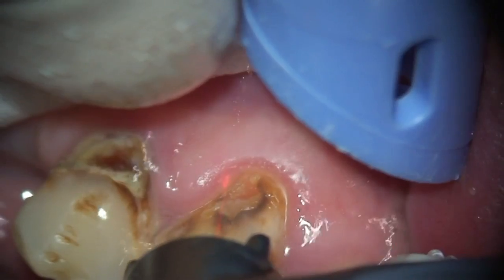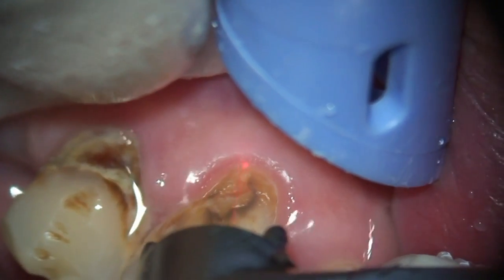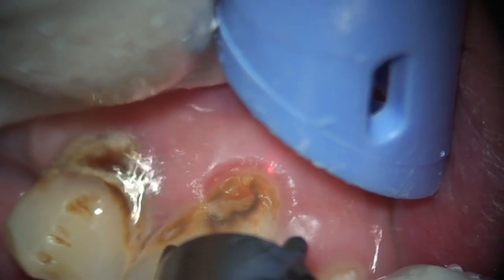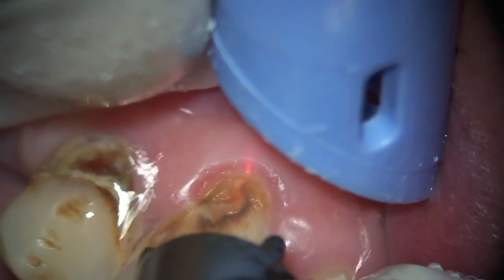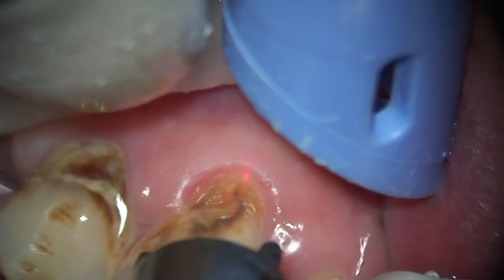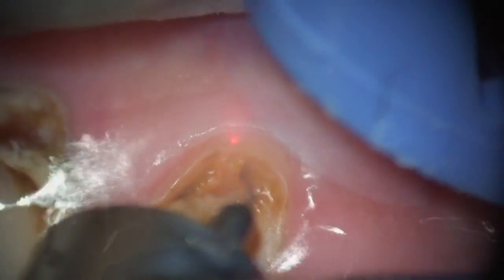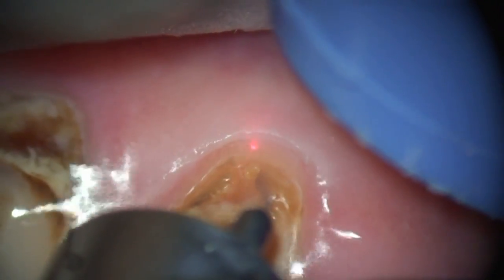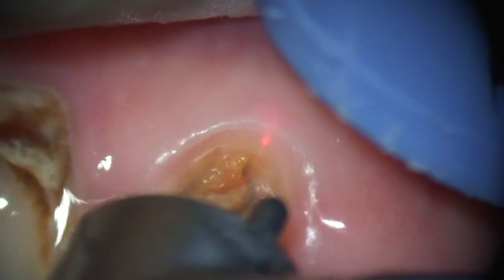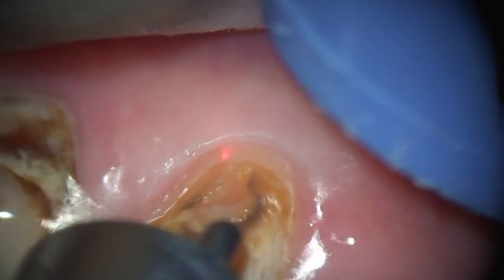One of the other advantages of the Erbium YAG PowerLase AT is the six variable digital pulse duration settings that the laser has. I'm using a 1000 microsecond pulse duration to expose the class 5 decay that I'm going to prepare here.